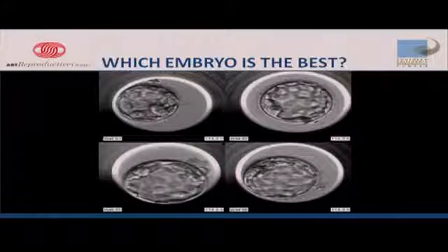But you need to know how it got from 1 cell all the way to the blastocyst in order to make the best decision possible, to rank them out. I'm not saying the other ones can't make babies, but they don't make them nearly as often. And if we use the technology of looking at like 3,000 different images across every embryo, we can find these minute, small changes that really decrease the chances of having a pregnancy.